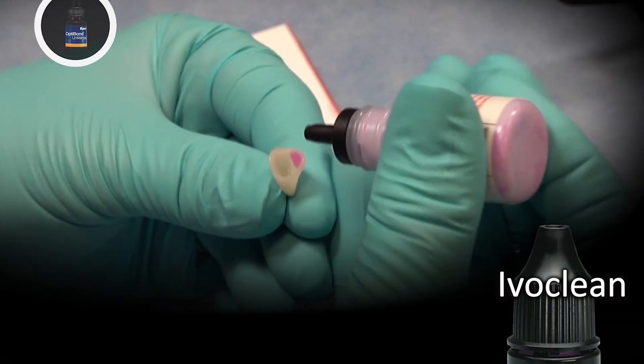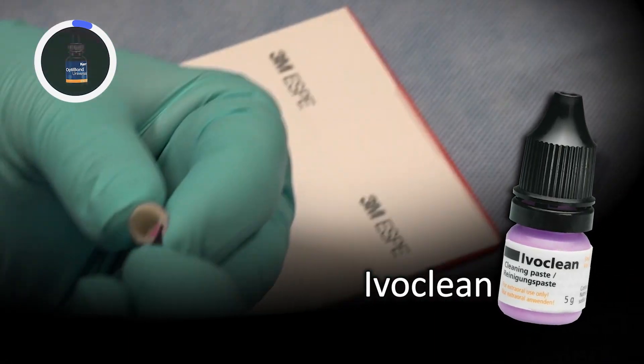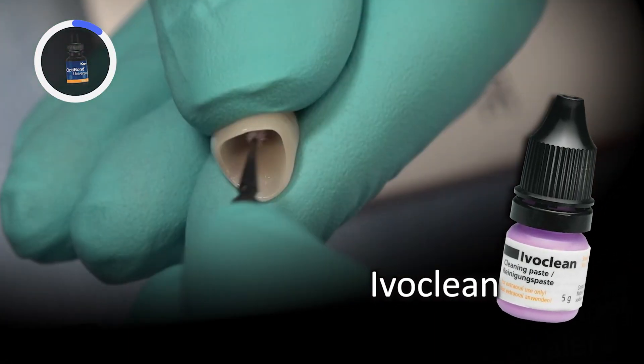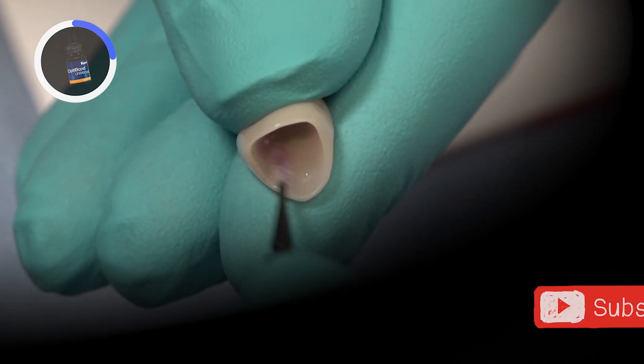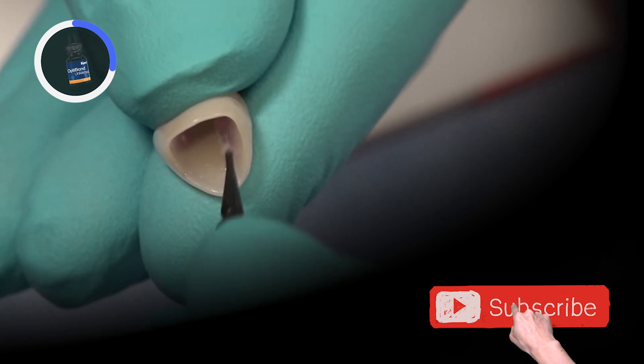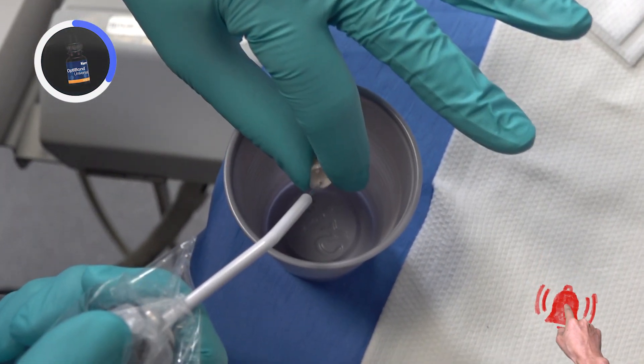We clean the restorations with Ivoclean to remove any salivary phosphate contaminants that can interfere with the bonding of these restorations. We allow the Ivoclean to interact for at least 20 seconds, then rinse and dry.